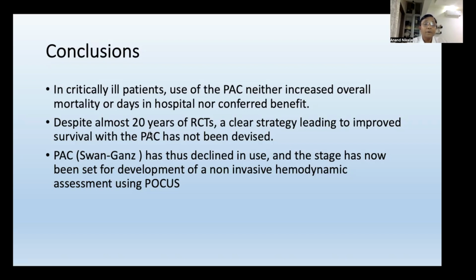And despite almost 20 years of multiple randomized controlled trials, a clear strategy leading to improved survival with the PA catheter has not been devised. There were multiple initial trials which showed a higher mortality when we use the PA catheter in patients of shock. With this background and evidence, the use of the PA catheter has declined in all the ICUs and theaters, even in the Western world. And then people started looking for some other non-invasive hemodynamic assessment tool, and PoCUS, that is point of care ultrasound, emerged as an important tool in the hypotensive patient.